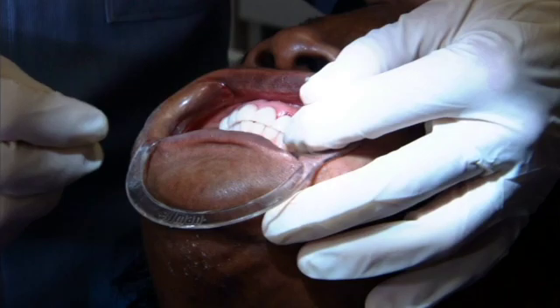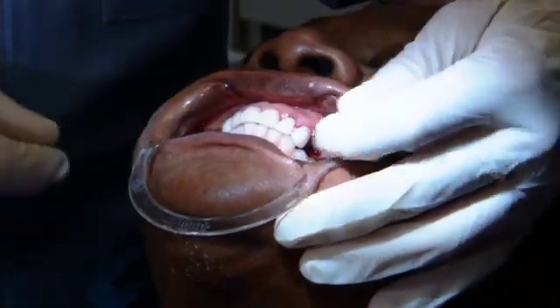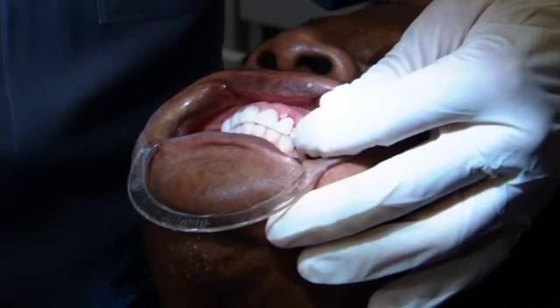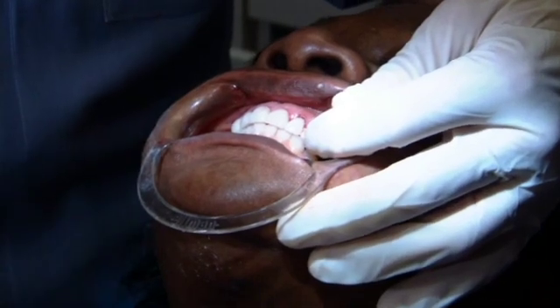This is why I think it's critically important to have the laboratory technicians involved in a case really early. Get them involved early. Let them start to look at what sort of shape and what sort of colors that we can deal with. Terry's done a real good job, and particularly in the centrals and canines, of picking up the colors just in the plastic.